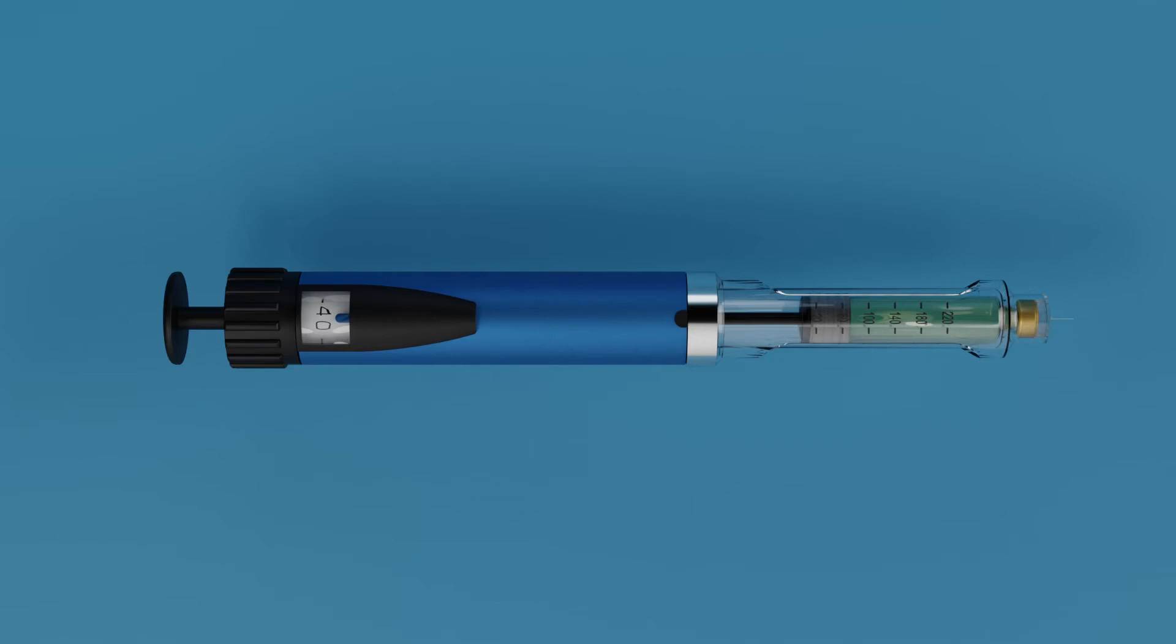In case you dialed more than the recommended units, simply dial the dose dialer in the opposite direction to reach the desired dose unit.